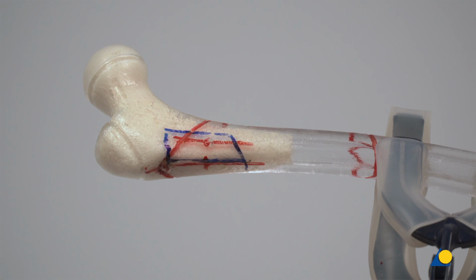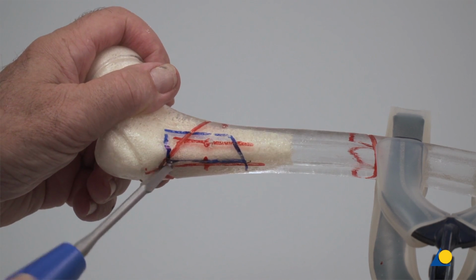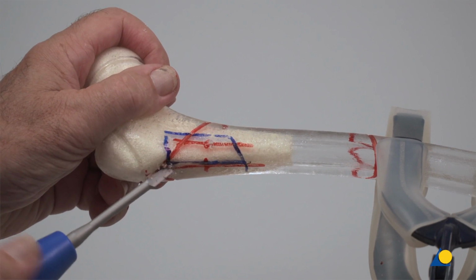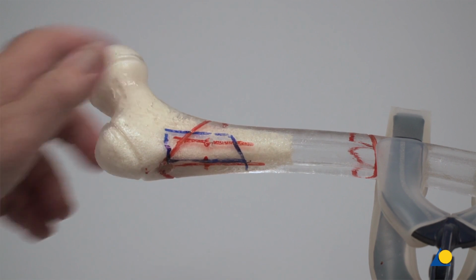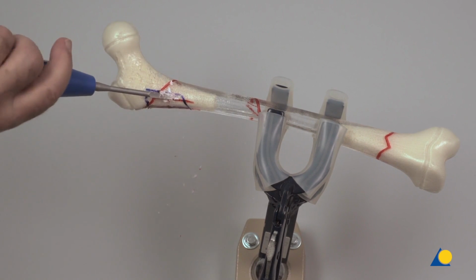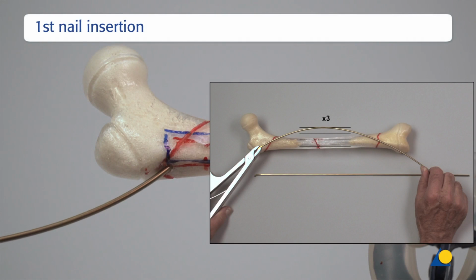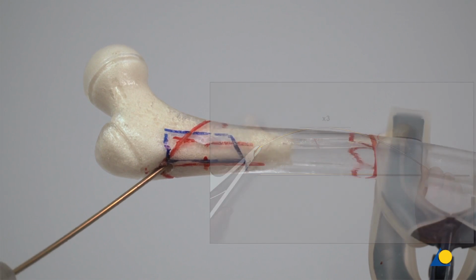The awl is inserted perpendicular to the bone. Once there is a safe grip, the awl is set to an angle of 45 degrees in relation to the shaft axis, and the bone is perforated. The steps are repeated to complete a second hole. The first C-shaped pre-bent nail is introduced through the more proximal lateral entry point.